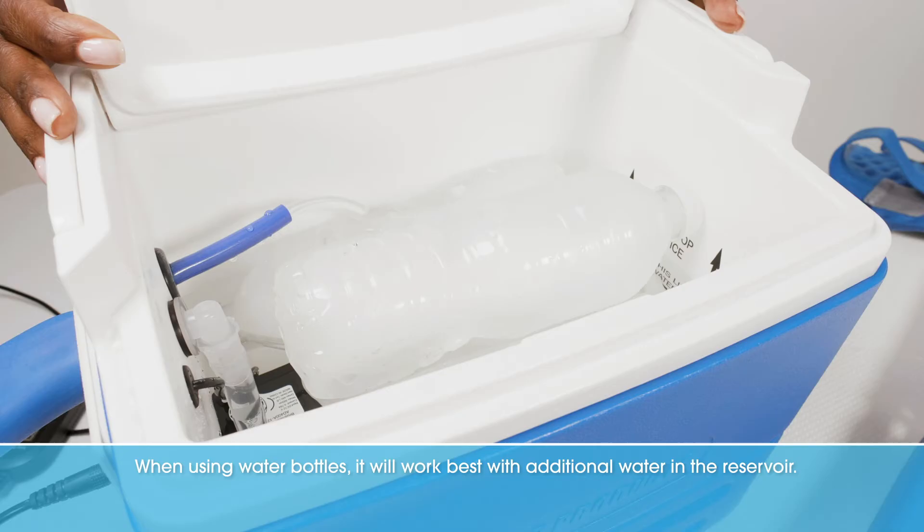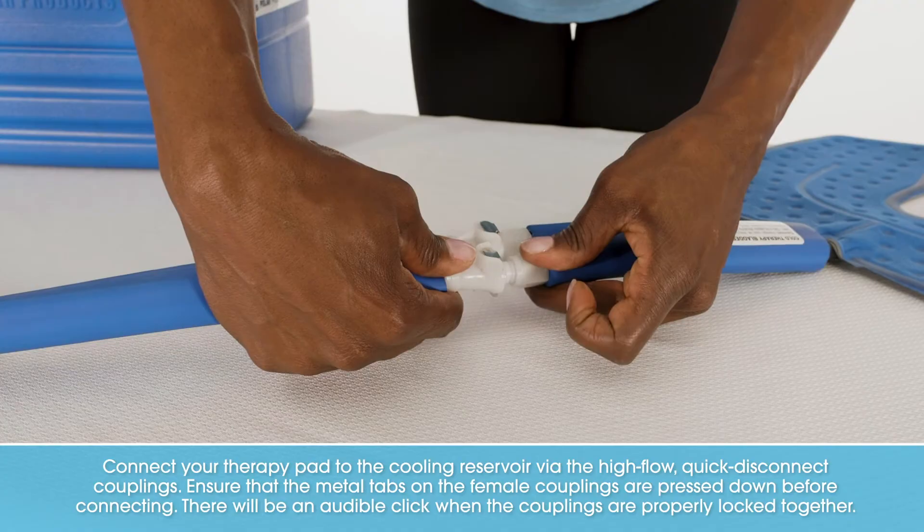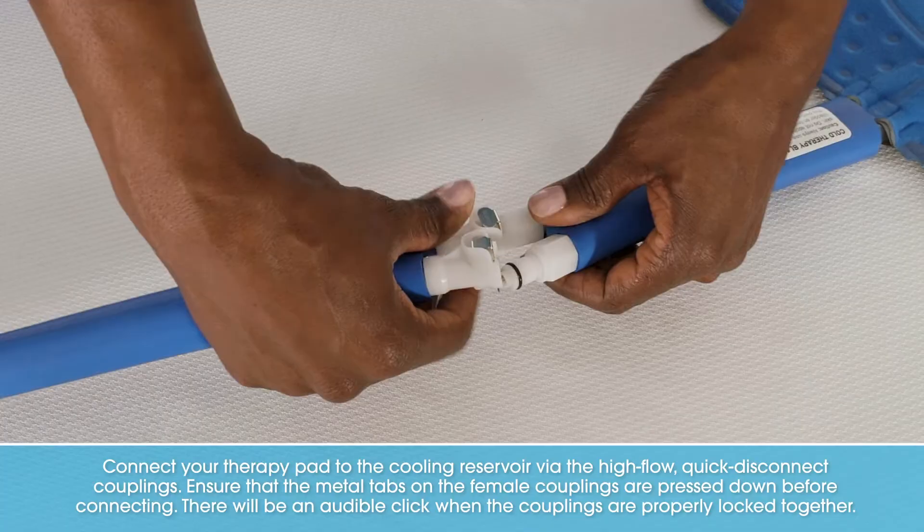When using water bottles, it will work best with additional water in the reservoir. Connect your therapy pad to the cooling reservoir via the high-flow, quick-disconnect couplings. Ensure that the metal tabs on the female couplings are pressed down before connecting. There will be an audible click when the couplings are properly locked together.